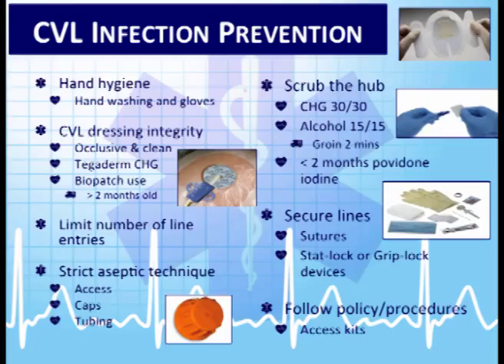Hand washing, we know we don't have sinks in the back of our ambulances, okay? What I would suggest for that is if we have a patient that we need to access their central line, we've had our gloves on probably since we started the call. We've touched everything in the ambulance, we've touched a patient, we've touched things in their house into the back of the ambulance. Take our gloves off, use whatever hand sanitizer that you have in the back of the ambulance, let that dry, and that's when we're going to go ahead and put on our new gloves.